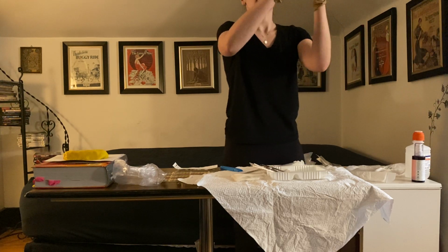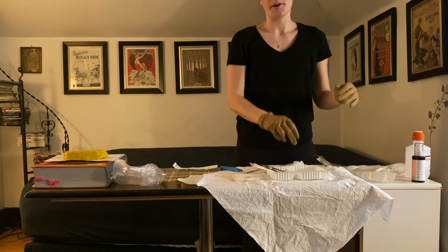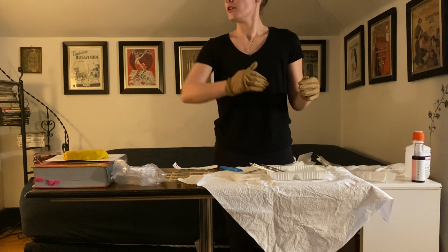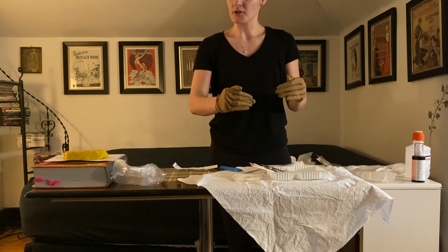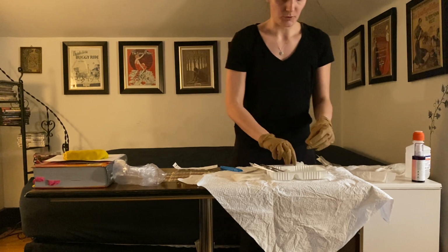I'm going to normally irrigate until the drainage runs clear, but I'm just going to draw up 10 cc's for the purpose of this video. And I'm going to work from cleanest to the dirtiest when I go. So I'm going to pretend the head is to the far right, and I'm going to go from more of the center to the outside. And I don't want to go really on the peri wound because I don't want to bring any contaminants into the wound bed.